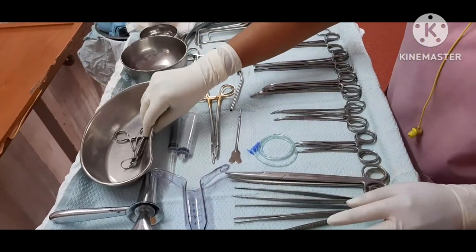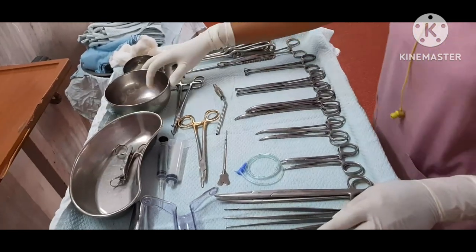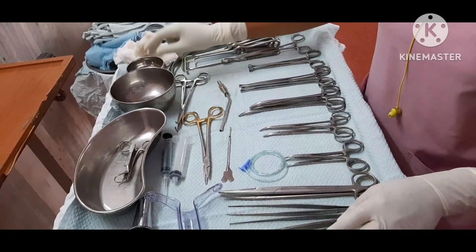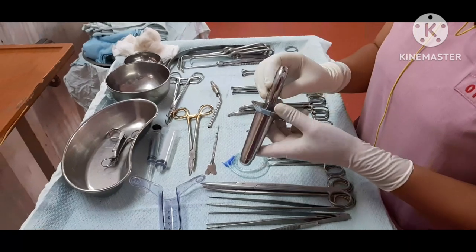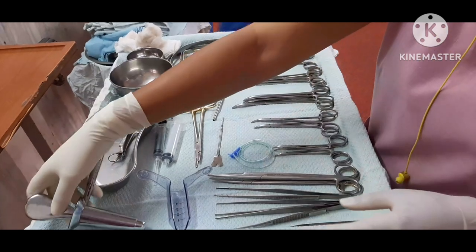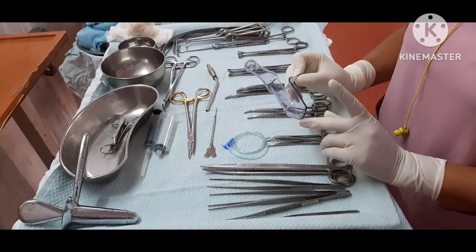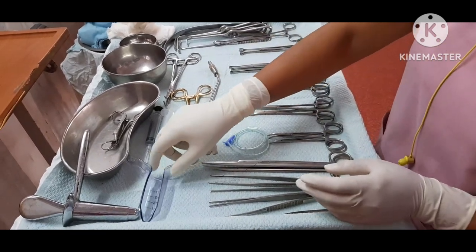Kidney tray. Towel clip. Bowls — one bowl for saline and a second bowl. Proctoscope, used to visualize the inner part of the structure. Disposable proctoscope — we use this for every patient; it can easily be visualized. We also have a fistula probe.